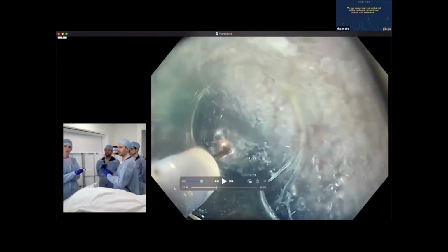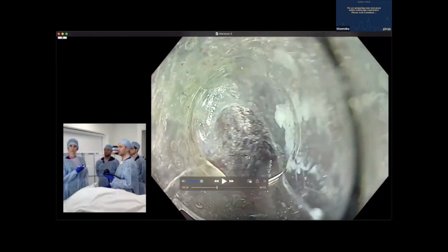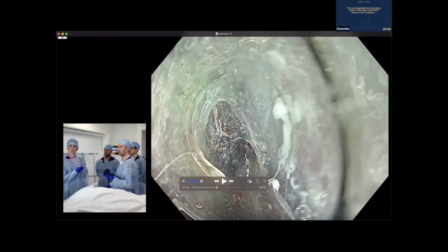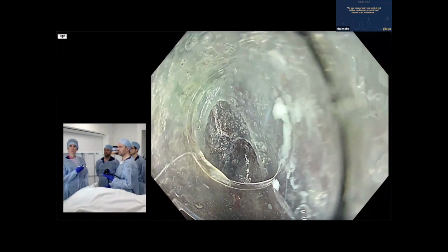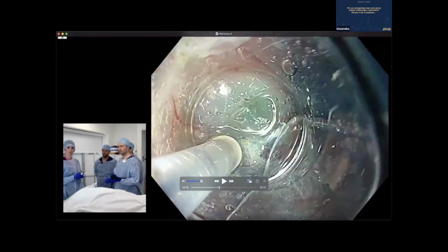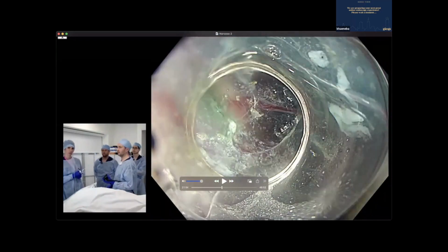So this is a bit of pocket creation, free one edge, free another edge. And then you think, as soon as you see your light almost in the middle of the roof of the tunnel, right? Then you think, okay, now it's not in the muscle. Let's just cut around it and remove it. I think you said that. So then using the triangle knife to do that, there you go, and I think you could see it here. Lesion, end of tunnel.